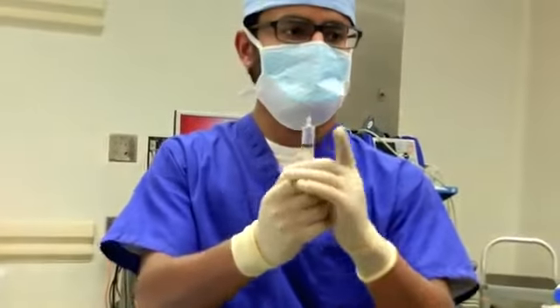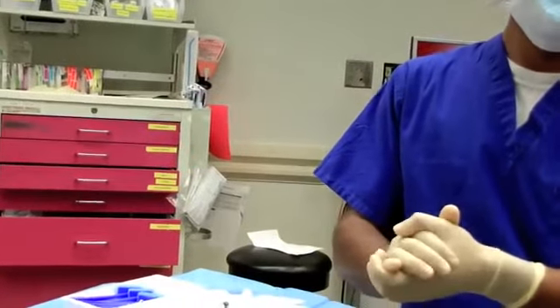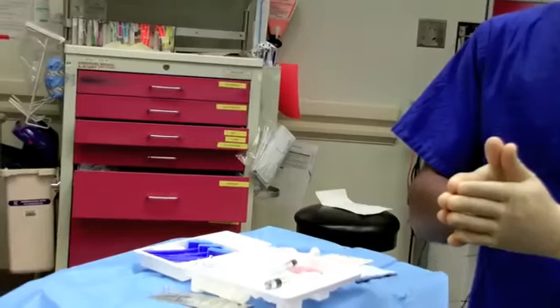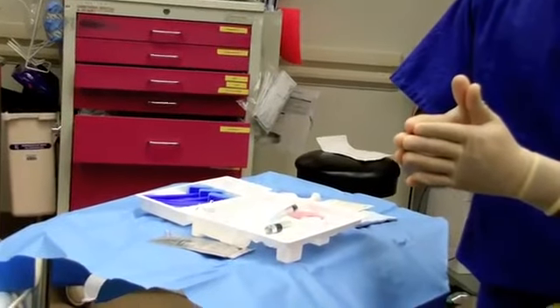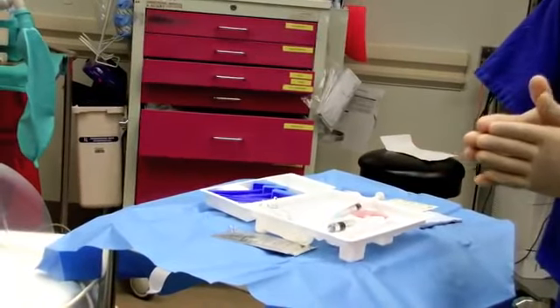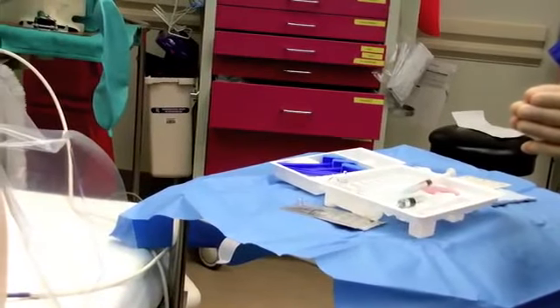Now, you're going to inject anesthetic in the correct location and angle. Superior aspect of the inferior spinal process in the midline. Approximately 15 degrees cephalad, as if aiming at the umbilicus. Horizontal plane perpendicular to patient's back, maintaining a needle in the midline position.